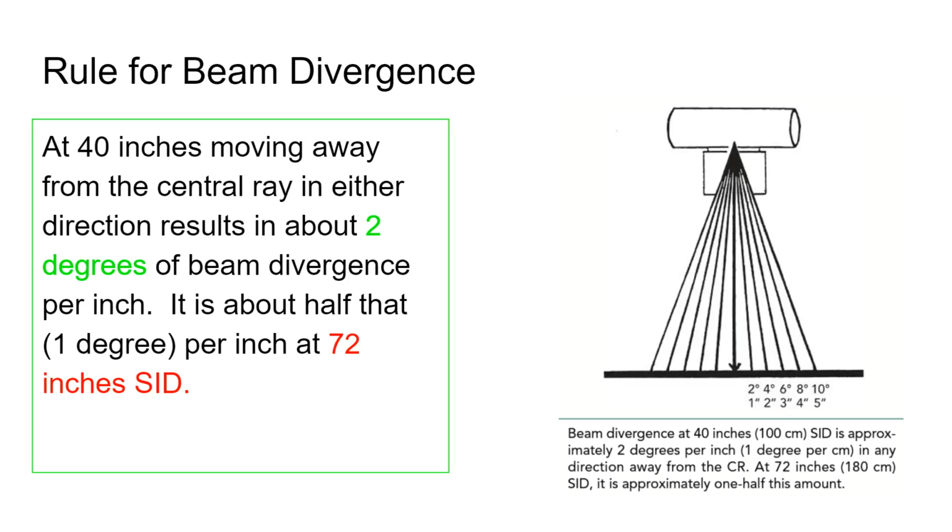And have you noticed that the flat panel detector is kind of like one size fits all? They don't have mini 10x12s yet. Maybe that'll happen one day. Right now you have a 14x17. So if they ask for a portable hand in the recovery room after the patient had some surgery, you don't take out your nice 8x10 flat panel detector, right? You take out what you have. So if you have a smaller object and a large image receptor, you're more likely to have your alignment off, because you just put it under there and you're like, I know I'm there, I'm going to get it. But this can possibly happen, right?